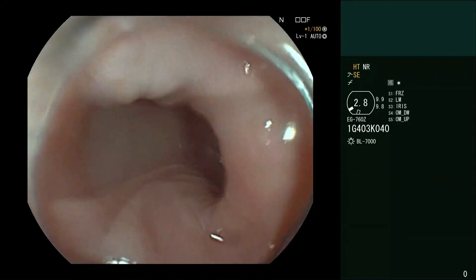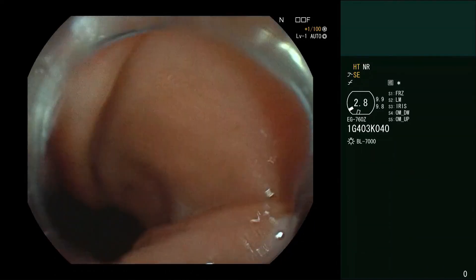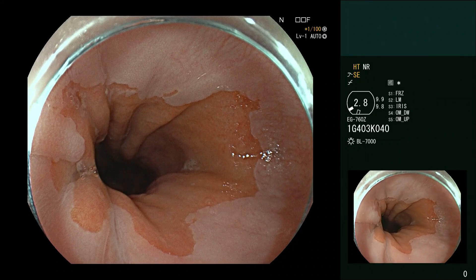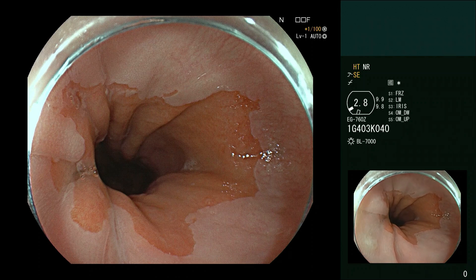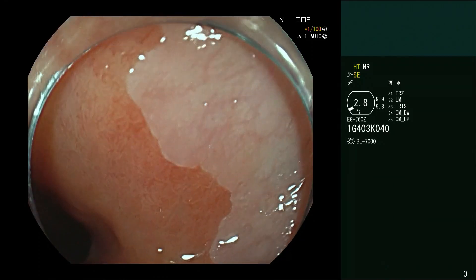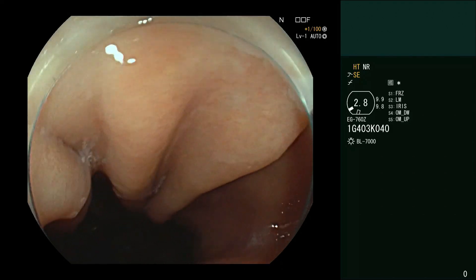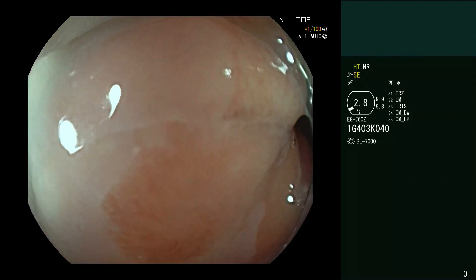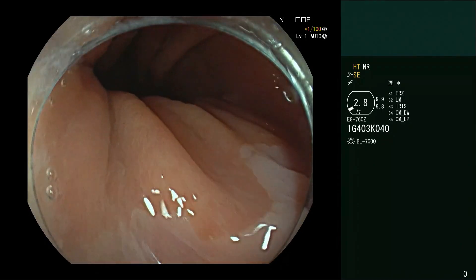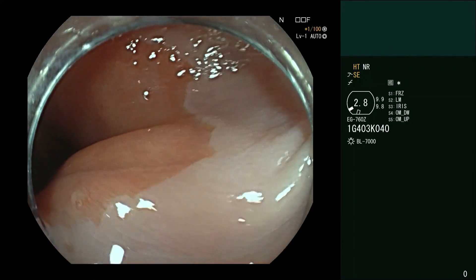The tunnel therefore would run down at the one o'clock position down to the junction. First stop: the junction — pause and make a decision about whether you see inflammation there. Do you see evidence of erosive reflux esophagitis due to acid reflux? We don't see that here. You can be more precise by looking around the junction, using the cap to splay the junction open, really focusing on making sure you see everything underneath all the folds, because otherwise you can miss subtle esophagitis.